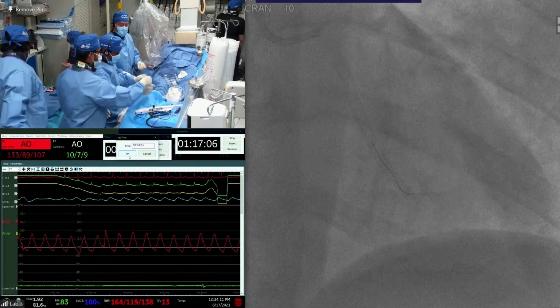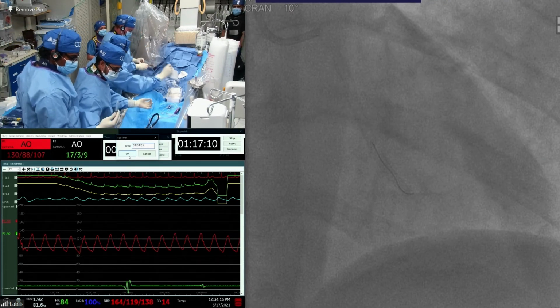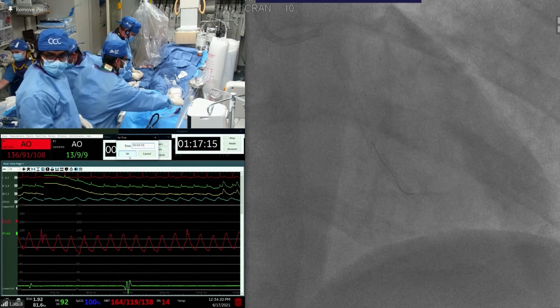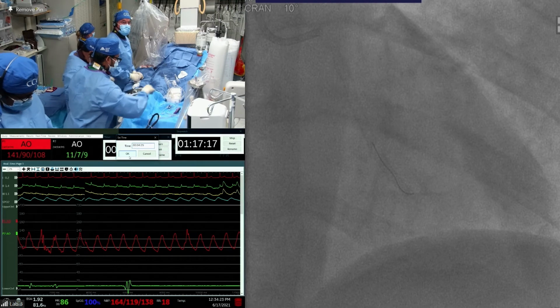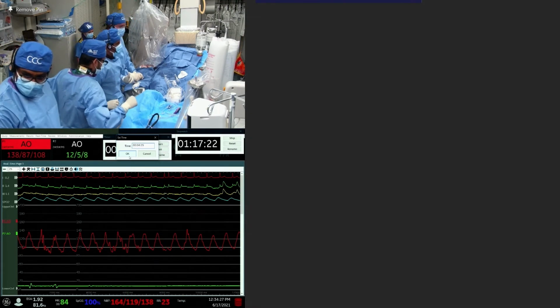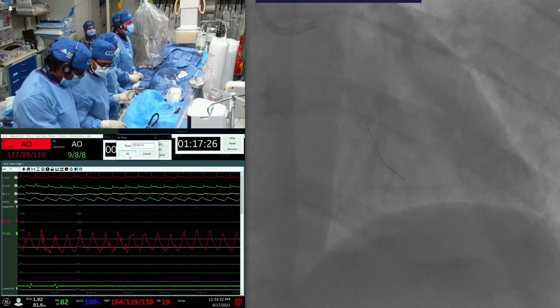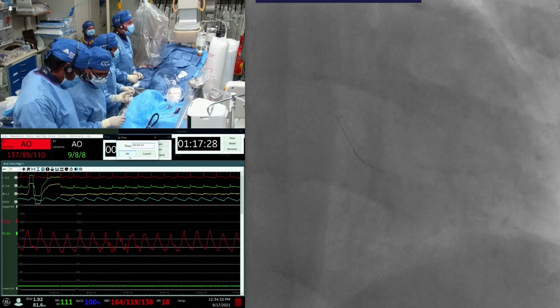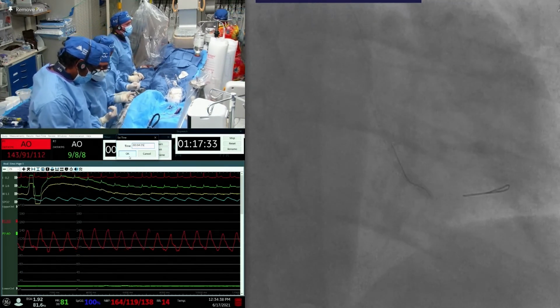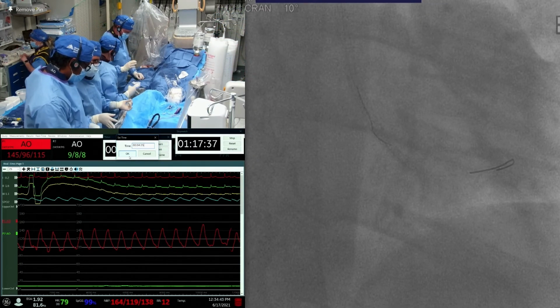Can we open Ron Waxman's microphone, please? Is it working? No, we think that one layer of ISR is enough. Brachytherapy is still going to save you another stent and probably will get you the best result. So I think that in all those cases that you showed today, even the underexpanded one, it's probably better to put brachytherapy instead of another stent.